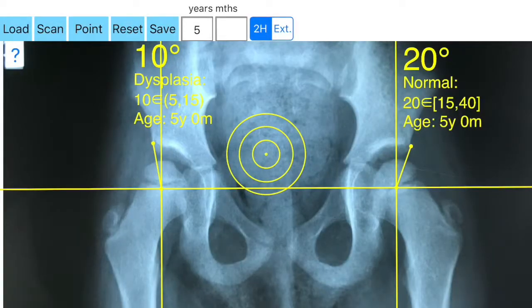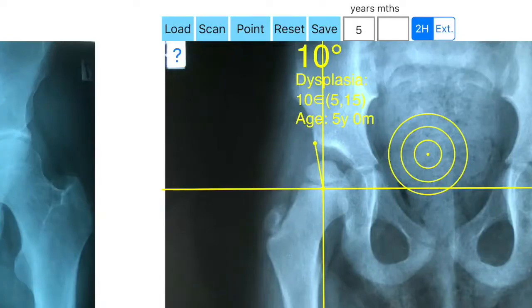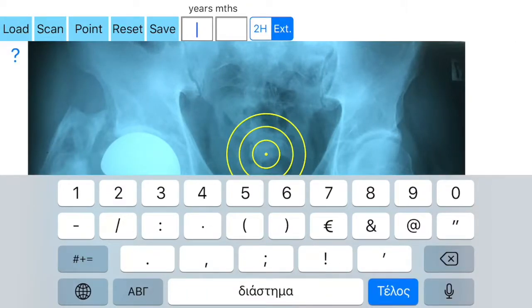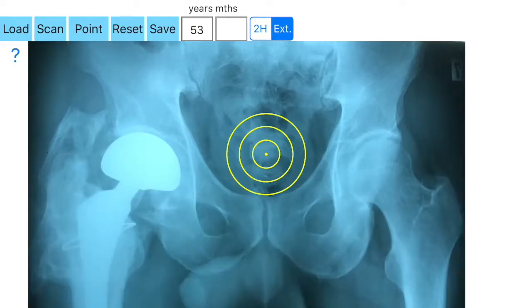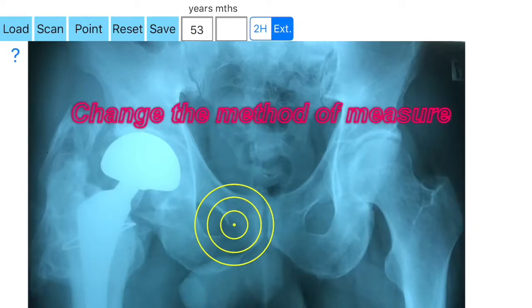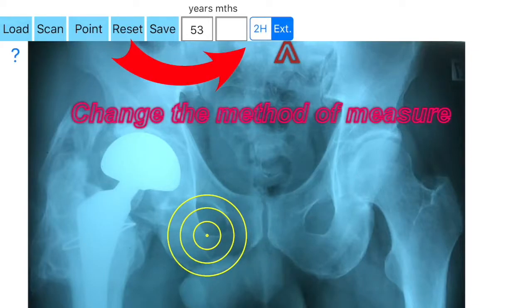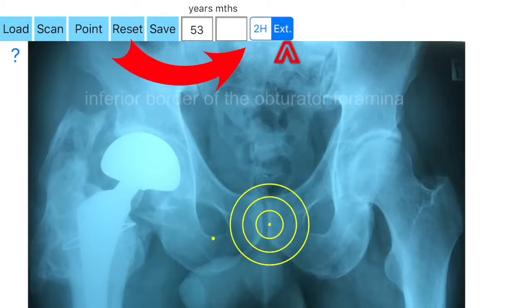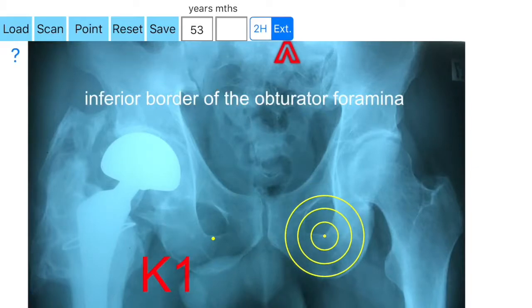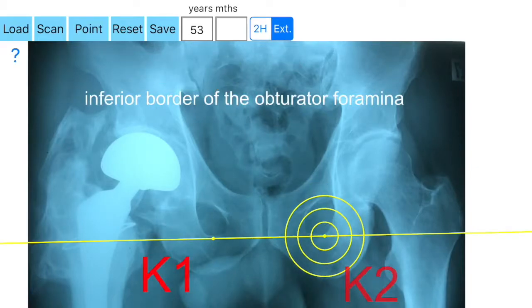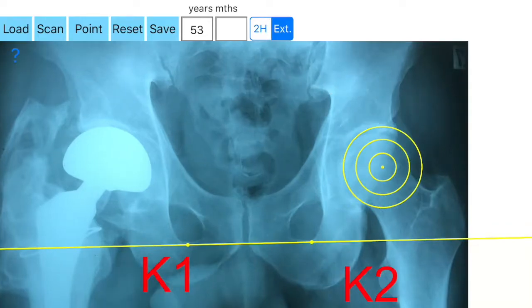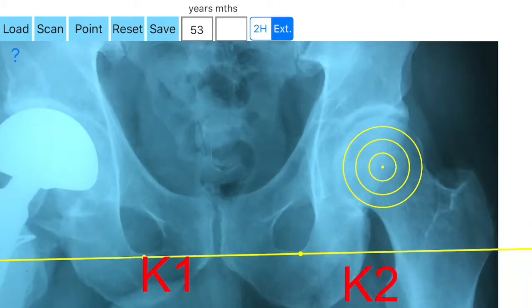In cases where you have leg length inequality, unilateral luxation of the femoral head, total hip replacement, or pelvic obliquity, you can choose another way to measure the CE angle by highlighting the option EXT. By pressing the option EXT, you activate another method of marking the points. Instead of marking both femoral heads C1 and C2, you mark two reference points.